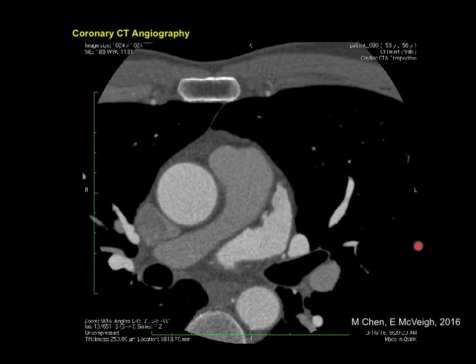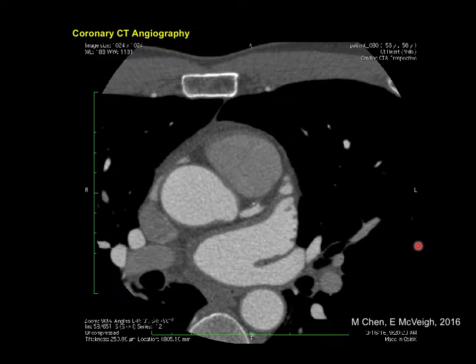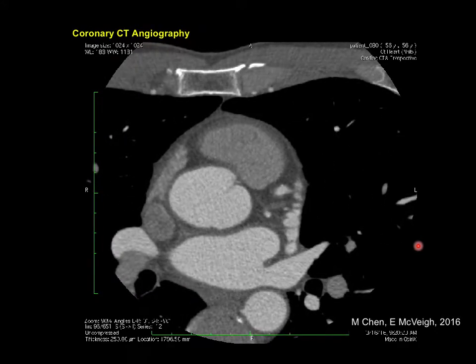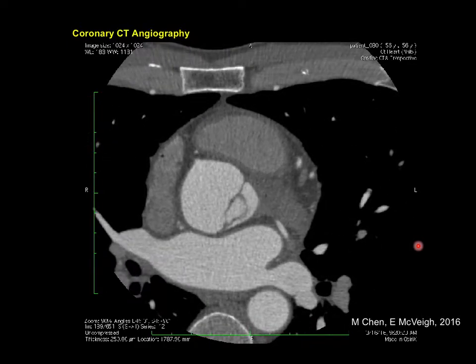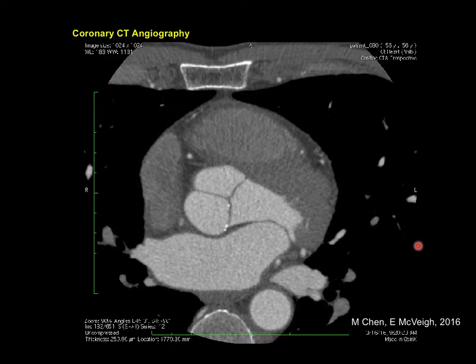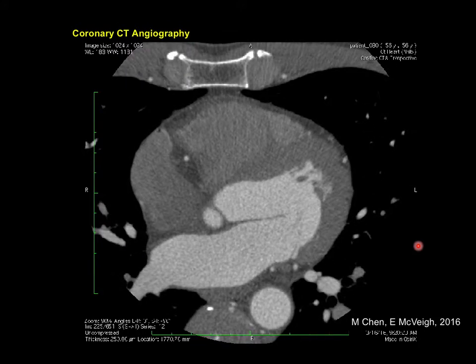But this is a really cool scanner. Take a standard detector that would be in a Philips, GE, or Siemens scanner: it's 1000 by, say, 128 or 1000 by 256, and the elements are about 1 millimeter apart at their centers. These guys put their elements 0.5 millimeter apart, in 2 dimensions.